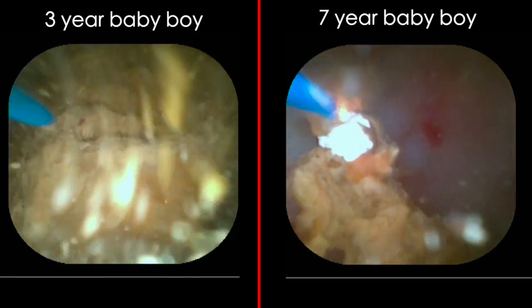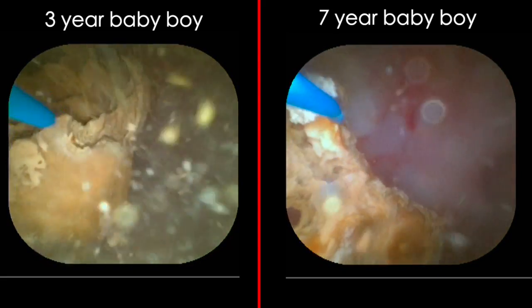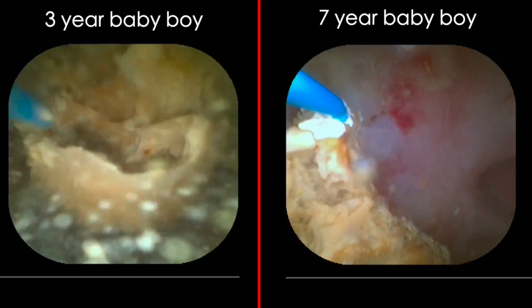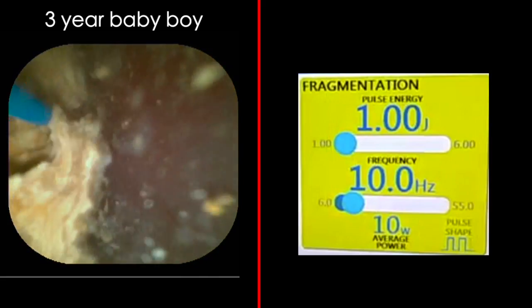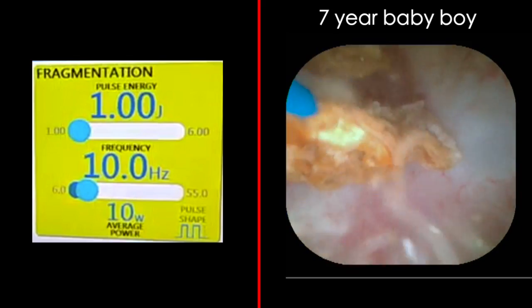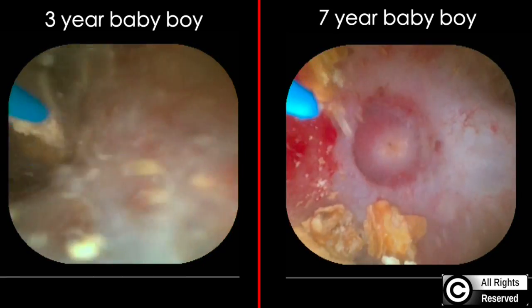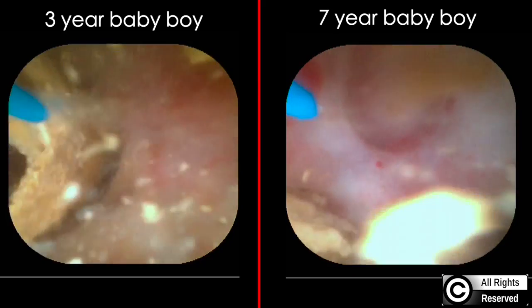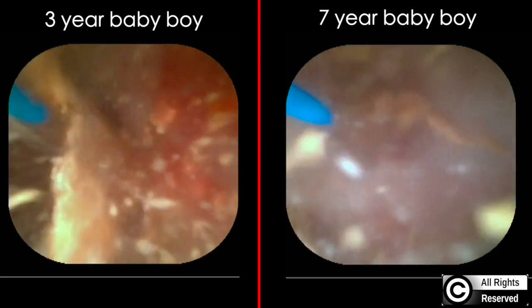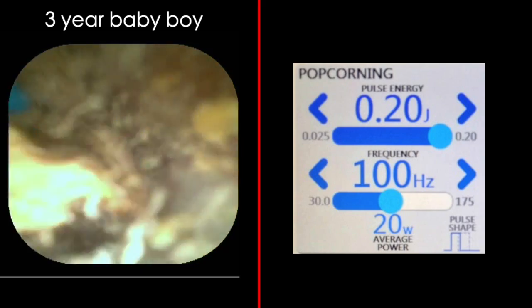White patches are seen on the right-side stone, which is unusual — it was not getting lasered initially. On the right side, fragmentation mode is used: 1 joule and 10 Hz. At the end, the popcorn technique is applied on the right side and then also on the left side. Popcorn settings are 0.1 to 0.2 joules at 100 Hz using the thulium fiber laser. The initial aim is to make as much dust as possible.